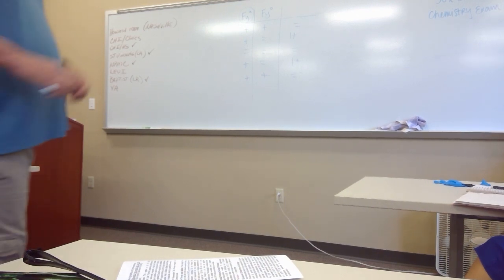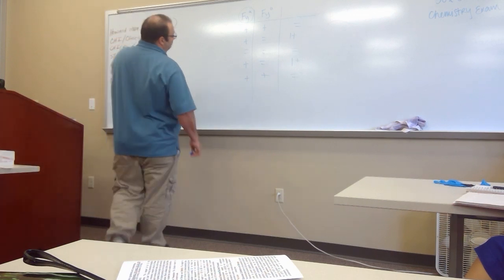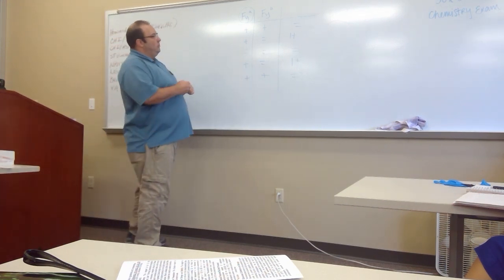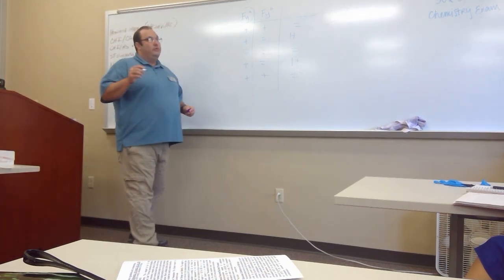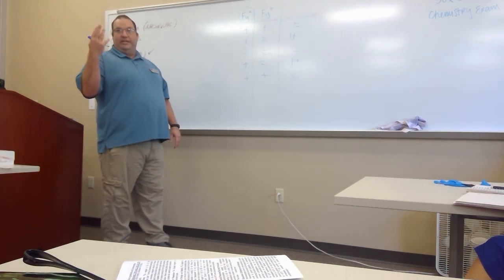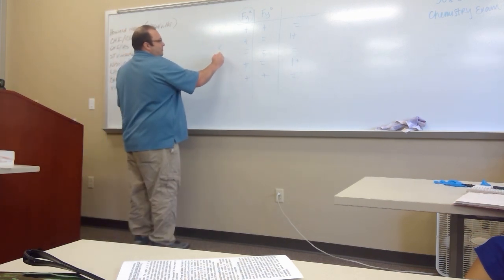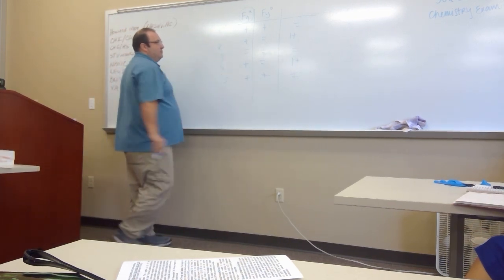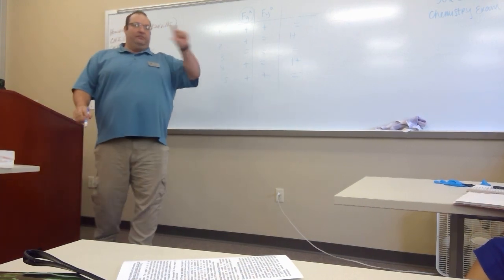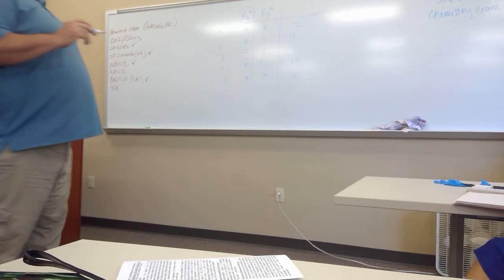Okay, so we have 5 rows of data here. Does each row signify a different patient? A different cell on your panel. Remember, antibody screen was 3 cells? This is part of a panel. This would be cell 1, 2, 3, 4, 5. Different bottles in that kit. Are being tested on the same patient? Yep.